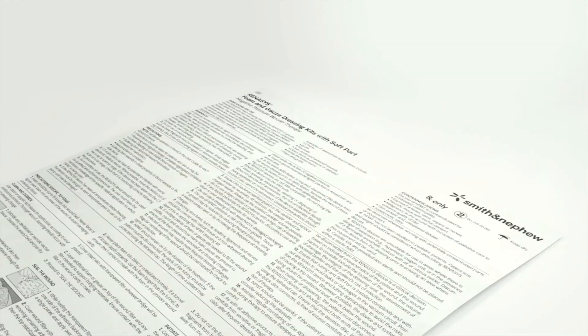Before using, refer to the Instructions for Use (IFU) for Indications, Contraindications, Warnings and Precautions.